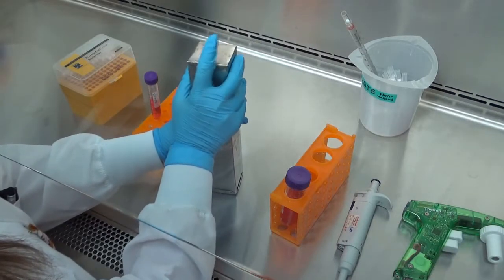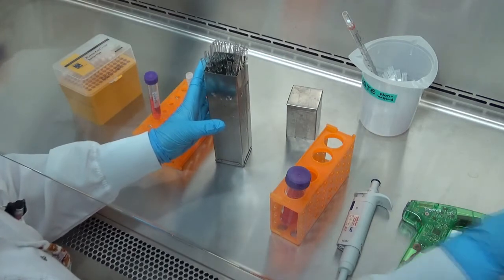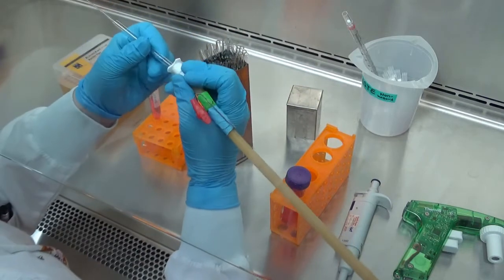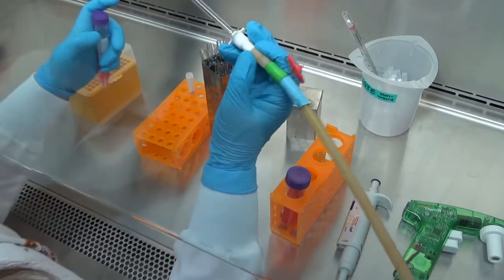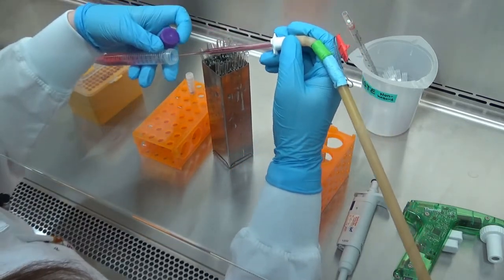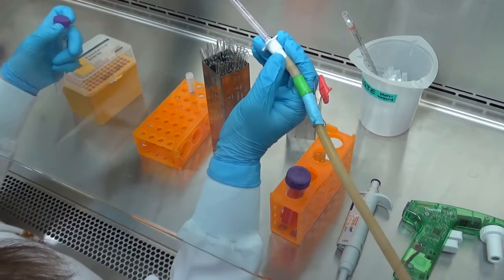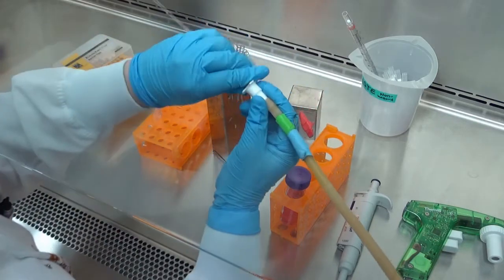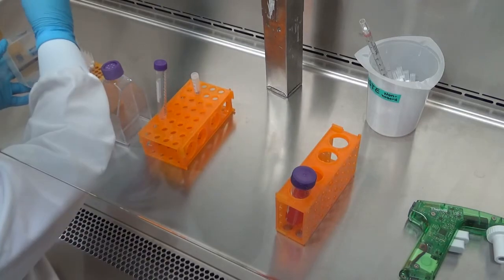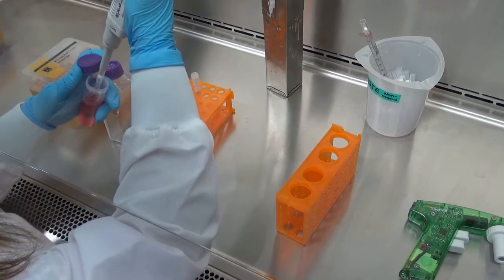After centrifugation, you should have a well-formed pellet. Aspirate the supernatant, being sure not to disturb the cell pellet. Resuspend the pellet in 1 milliliter of media using the P1000.